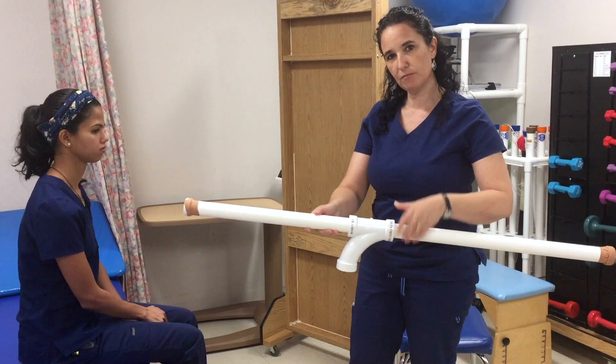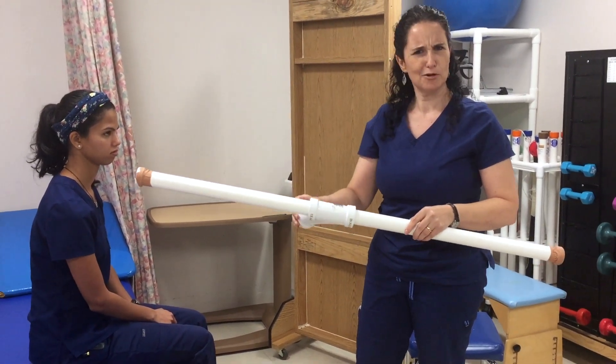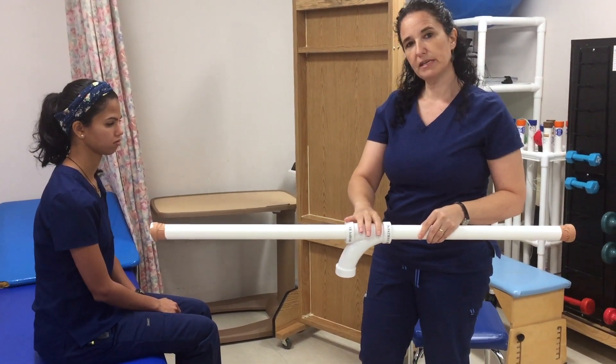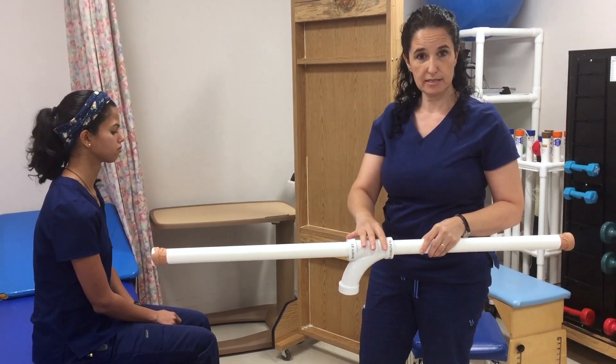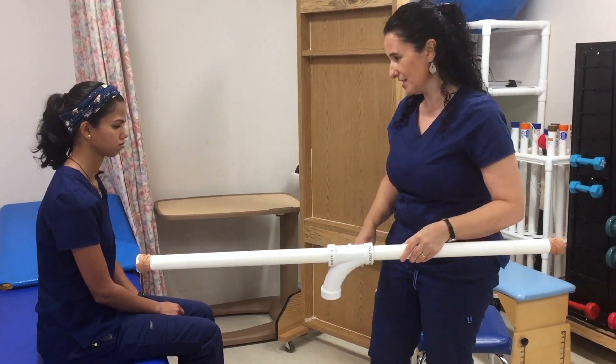The first one is a PVC pipe I just got from Home Depot, and another piece — you can call it an elbow. You can use this for gravity-reduced exercises and active-assist exercises for the upper extremity. Let me demonstrate for you how to use it.